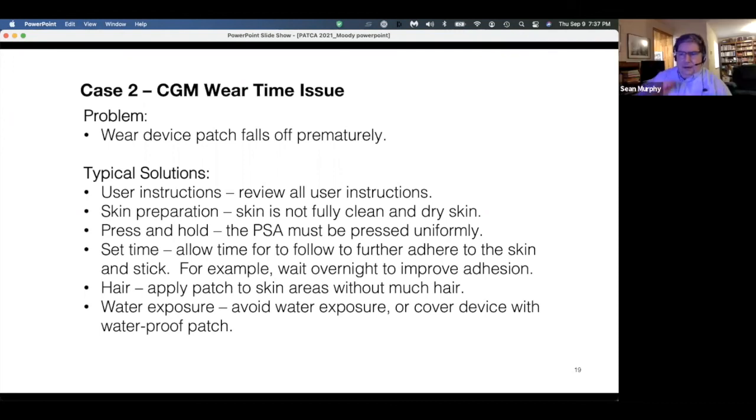Is there any other preparation that's done to the skin? Is there like an ethyl alcohol wipe or isopropyl alcohol? Yes, on the cleaning procedure, often it's soap, and they might have some different wipes. Some don't want to use too much alcohol, so there are some different preferences on that. Often there'll be a cleaning instruction, but often it's soap and water. But then people will start to use the alcohol wipes and that can over-dry the skin. You've got to be so careful with these long-term wear products that you don't start to sensitize your own skin from, let's say, too much cleaning, too much drying.